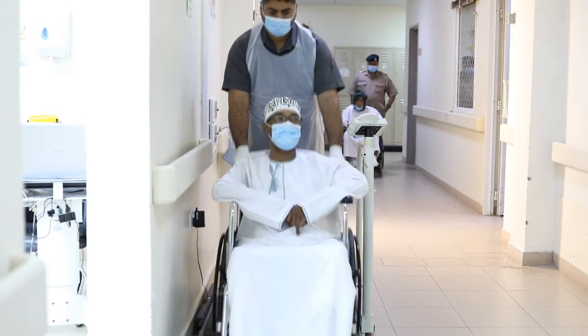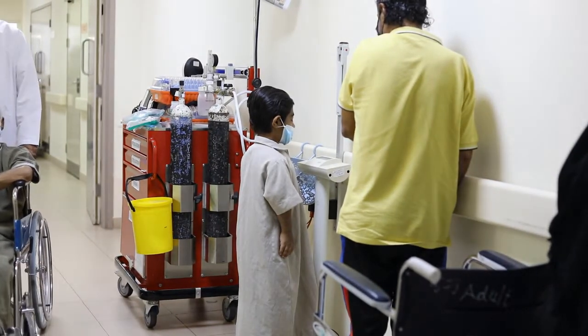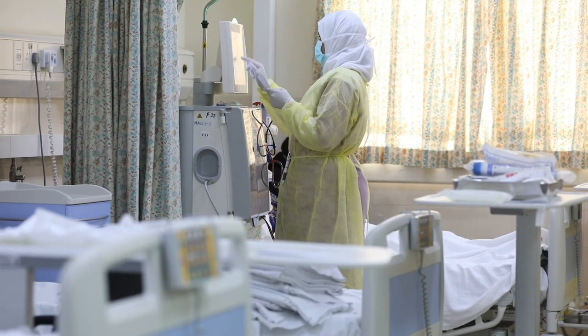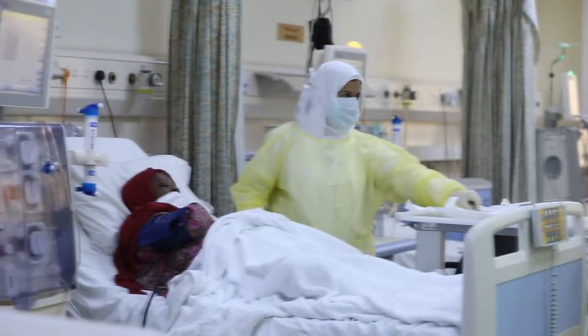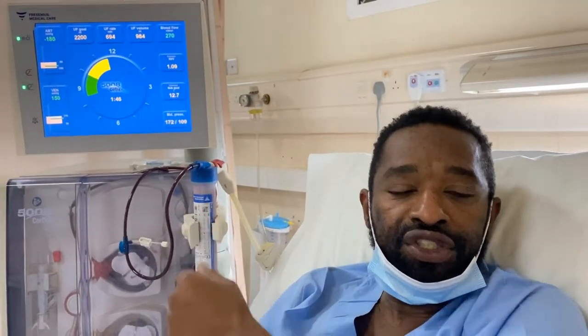Since I lost my job, luckily I'm in Boucher Kidney Dialysis Center, where there are doctors and sisters and brothers helping us in many ways in doing proper dialysis, which helps us get healthier, because as kidney failure patients we can't get proper blood clearance except if we go through this machine, which is the dialysis machine.